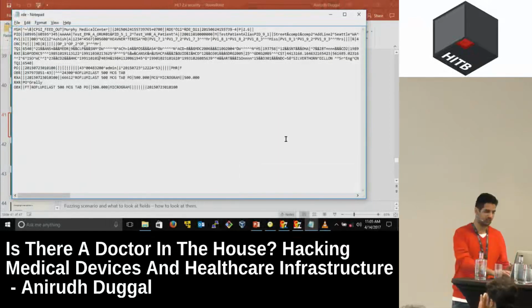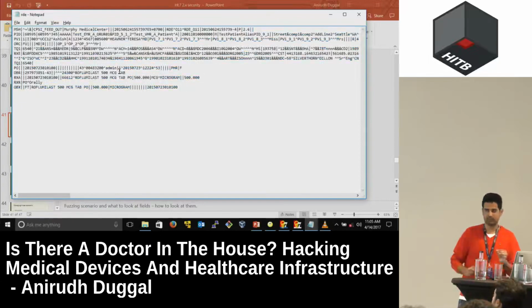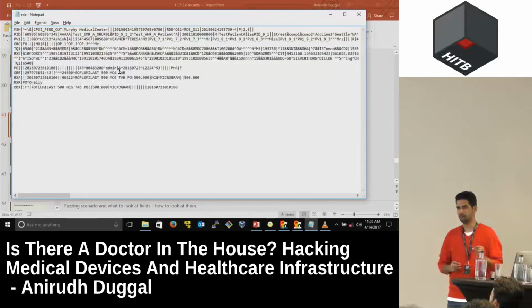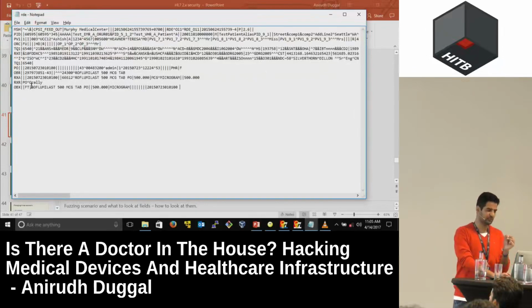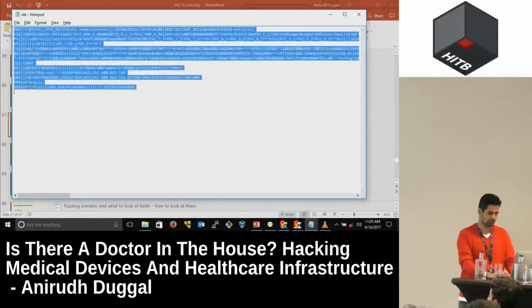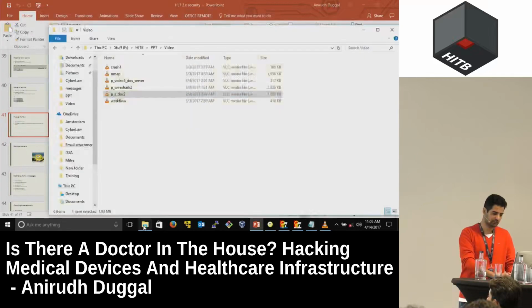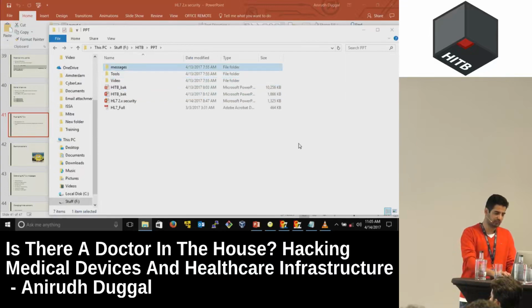The reason is you have a payload which is something like this, all right? You need to understand the kind of fields that you're fuzzing, and that has to be very, very specific. So if you're fuzzing this field, your first parameter has to be here. Instead, the vendors would actually send you this, all right? So you need to keep your payload really, really specific, and you really need to understand what kind of system you're attacking. And that, in my opinion, is the fuzzing that you want.